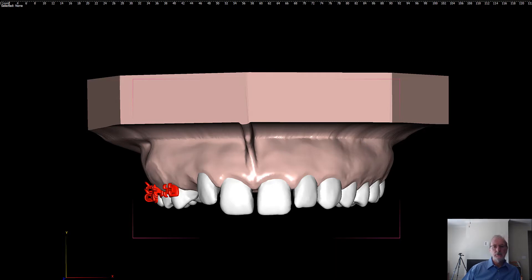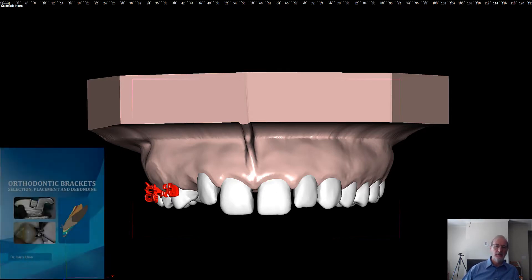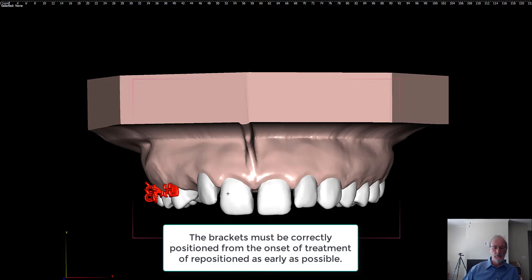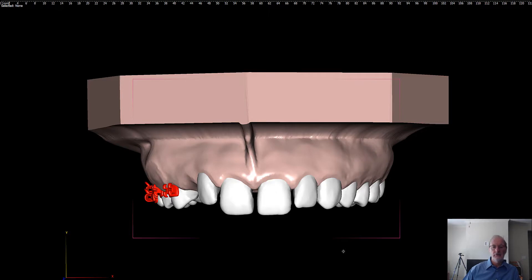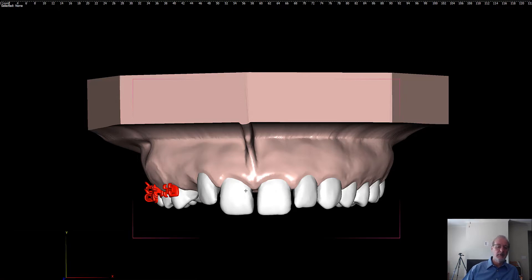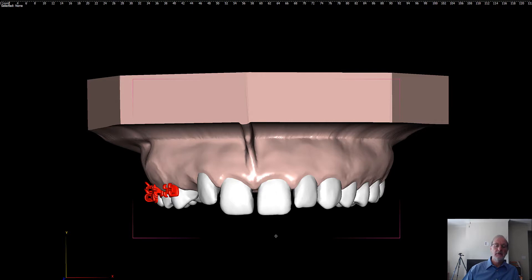Orthodontic bracketing is one of the most important procedures in orthodontics when using fixed orthodontics, and it's oftentimes overlooked for the sake of speed and efficiency. It's very important to understand that if you do not position your brackets correctly, a straight wire system will only express the poor position of your brackets, and the teeth will end up incorrectly aligned, which is very frustrating at the end of treatment. To avoid these problems, we'll look today at how to bracket teeth correctly, starting with the central incisor.